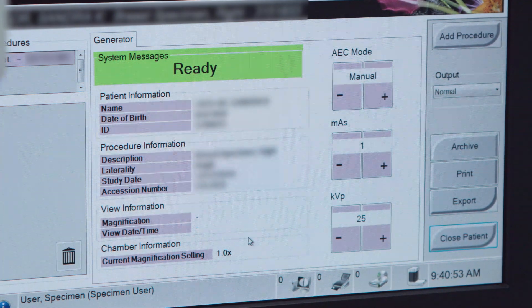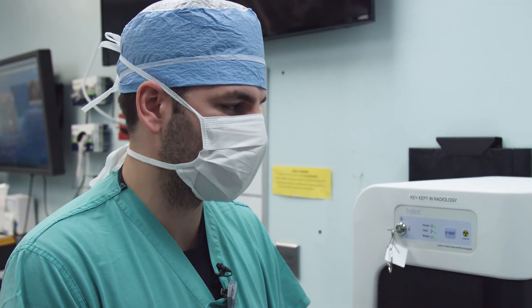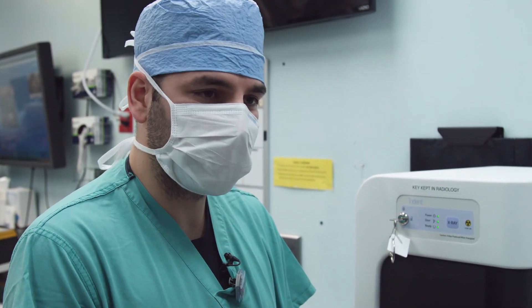From opening the door to the image popping up is probably about two minutes — it's very quick. The biggest thing is we get better images, less time under anesthesia, and it's good for the patients as well.